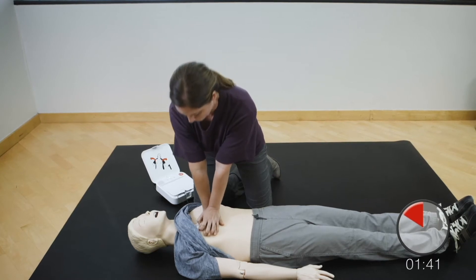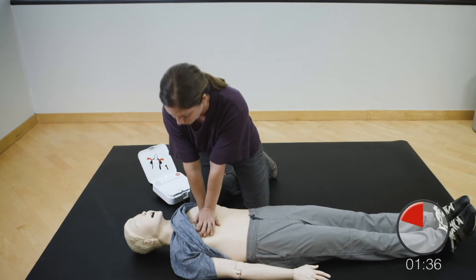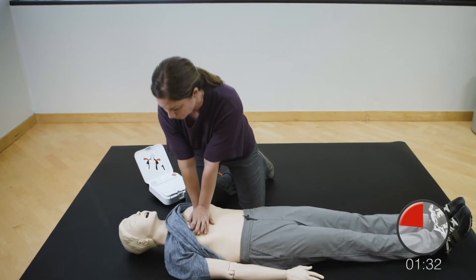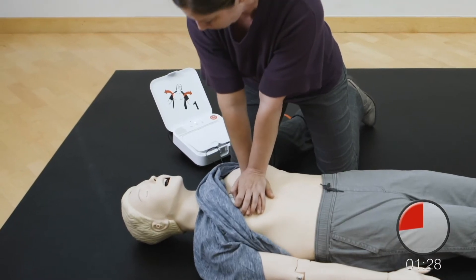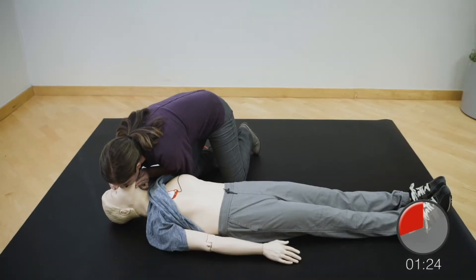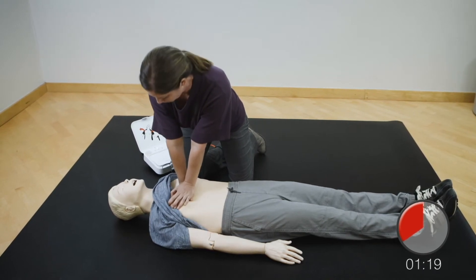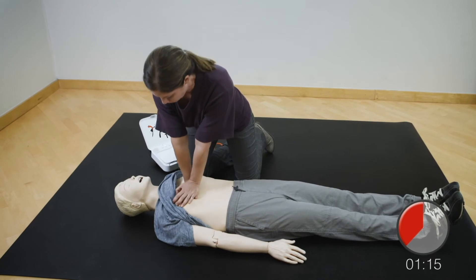Resume chest compressions. Push down hard at least two inches. Provide two breaths. Resume chest compressions. Push down hard at least two inches.